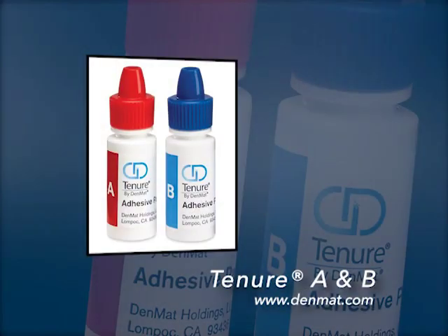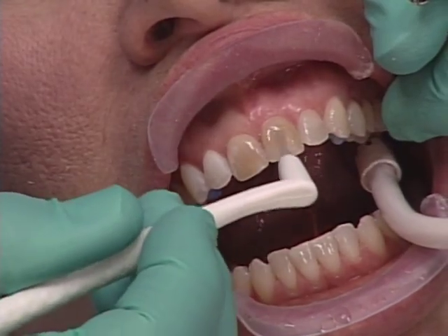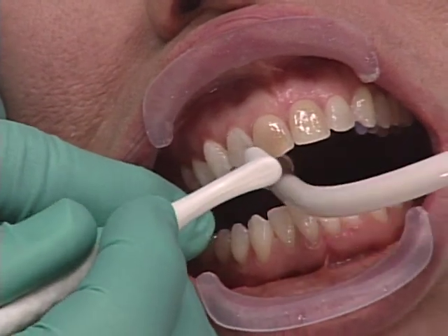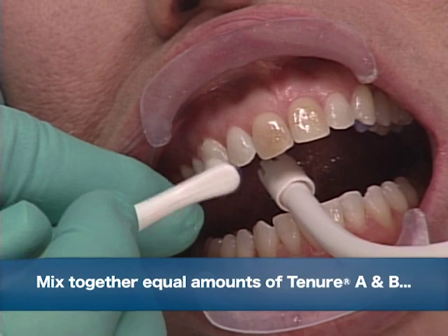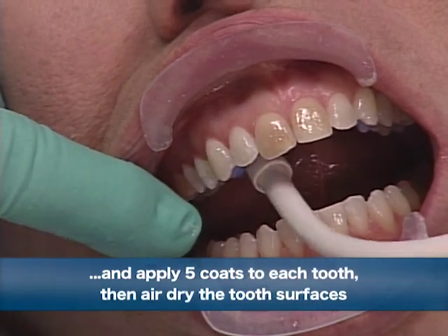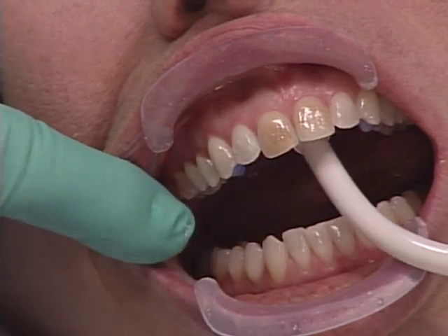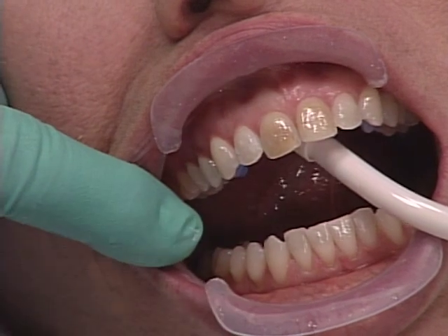And then the next step is we're going to put Tenure AB on this. The reason I use Tenure AB, we worked with it and got it down to 2 bottles, 1 step. And the significance of that is that some systems out there won't bond to self-cured systems. And Ultra Bond is light cured, and it has a little kicker in there for self-curing if you don't get enough light to the Ultra Bond.